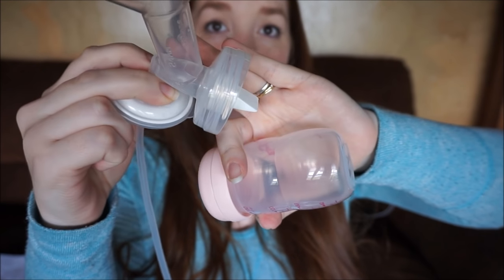Personally, I like the duckbills. I had not used them before this pump and I actually really enjoy them. I should mention this is the S2 that I got before they recently launched the S2+. If you get that, you get the 24-millimeter flange and also the 28-millimeter flange. That is the difference between the two — everything else is the same.